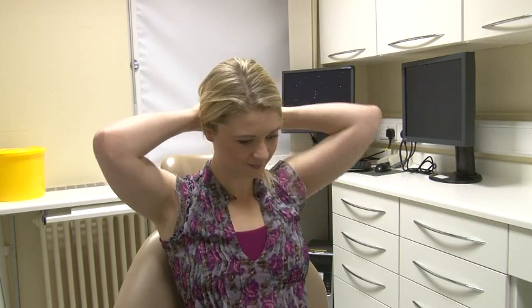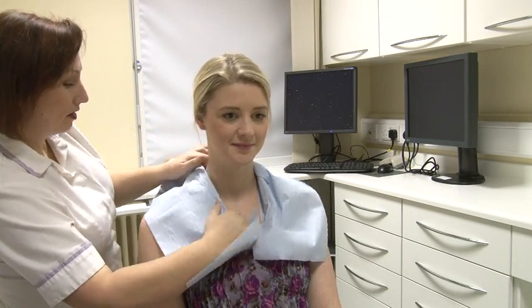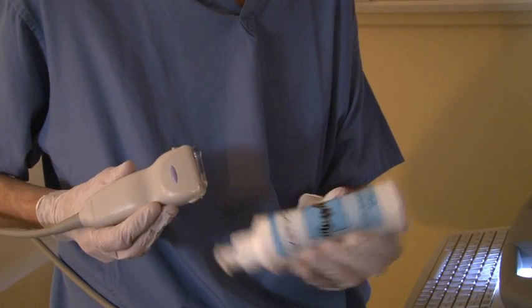If you have long hair, you may be asked to tie it up. Paper tissue will be placed around your collar to prevent jelly from getting on your clothes. A clear water-based jelly is placed on the probe to ensure a good contact between the skin and the probe.